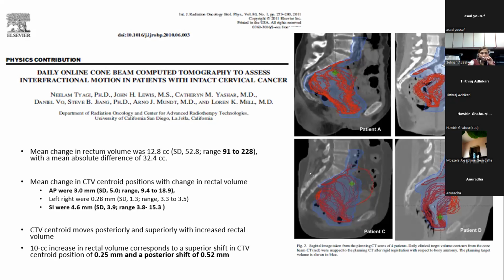This is another paper, and in this paper, the author talked about the change in the position of the uterus. They talked about the impact of the organ motion.